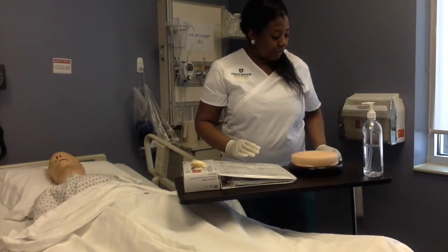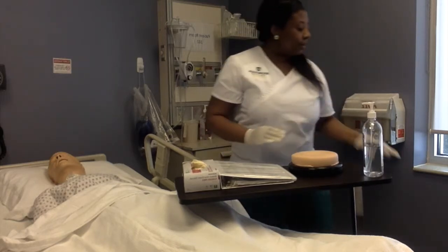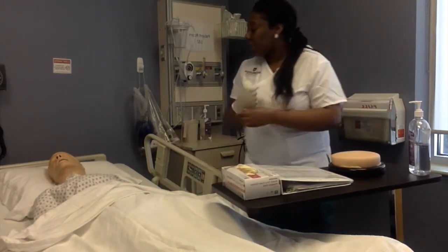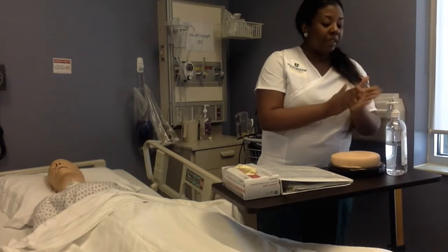And I want to put the safety on the needle, place it into the sharps container. Alright, so are you doing okay? Good deal. Okay. After my injection, I want to perform my hand hygiene.